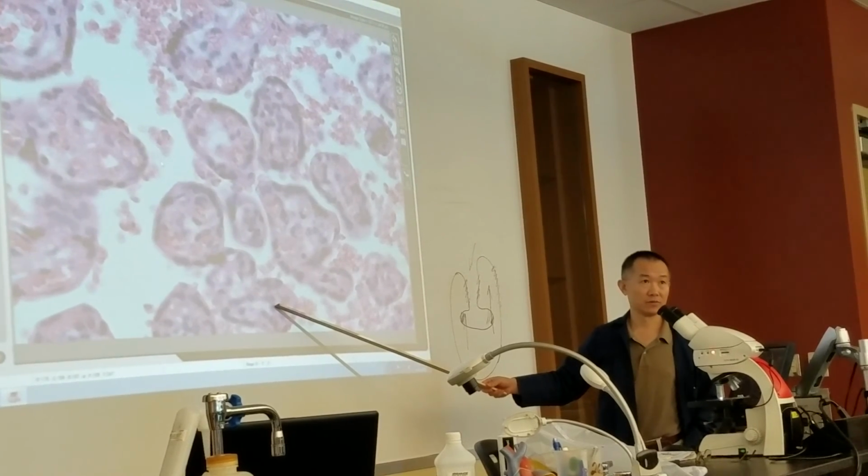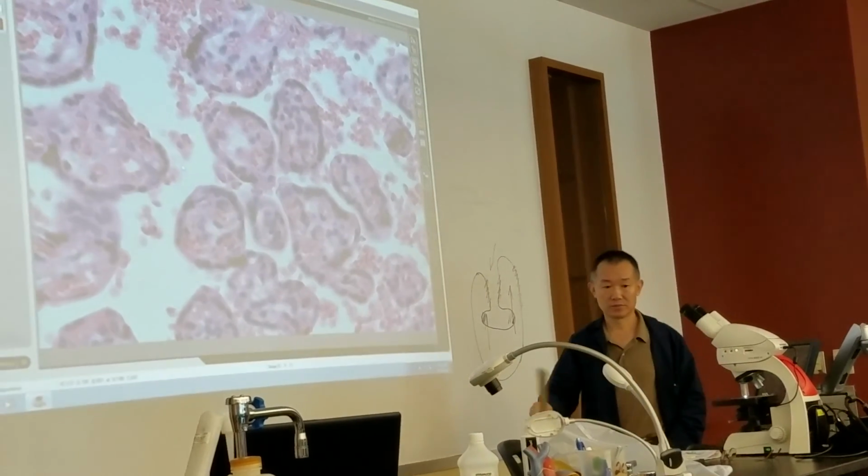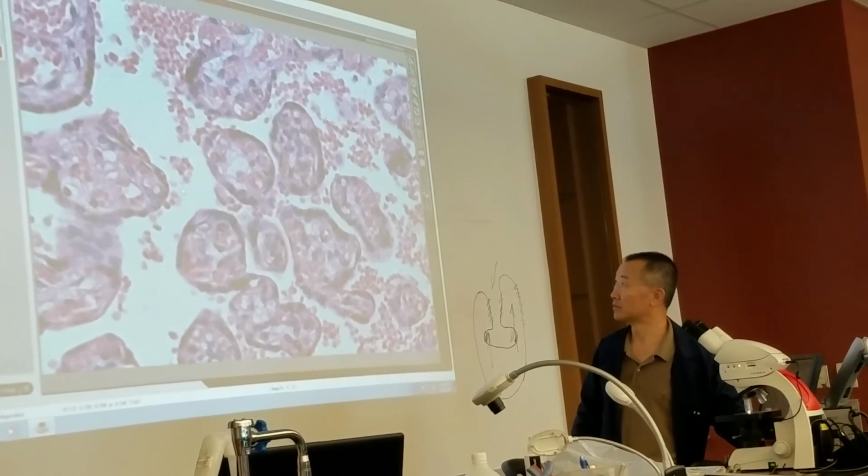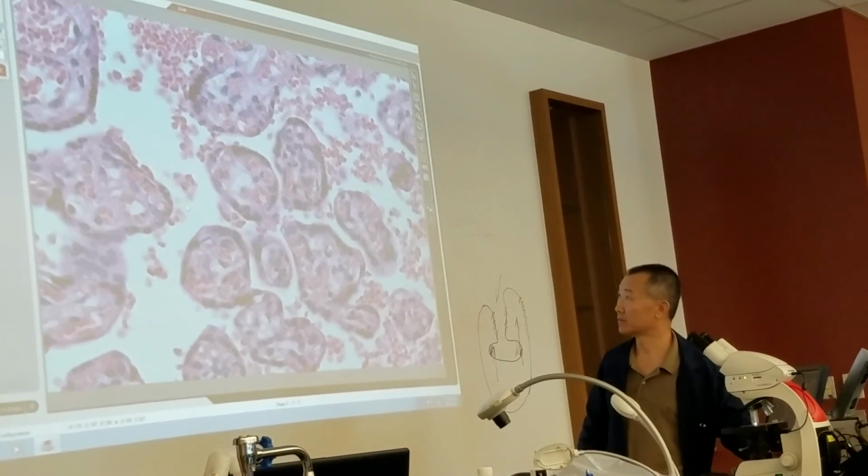Can you focus the image? Can you focus the image? That's better?